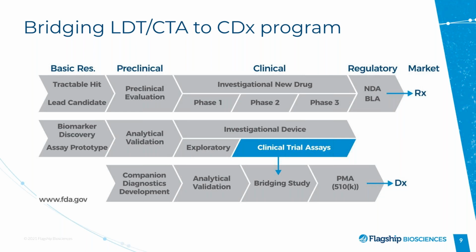Ideally, you want to acquire samples that are very similar, if not identical, to the samples you'd be testing for your phase 3 trial. So for us, it's buying FFPE resections of the oncology indications that we're interested in. A lot of our patients will have endoscopic biopsies, so can we acquire enough of those? Some patients might have core needle biopsies. Can we find those? I can say from my own personal experience that this can be challenging to do. It can take a while, and not all of the tissue samples that you might want could be available.